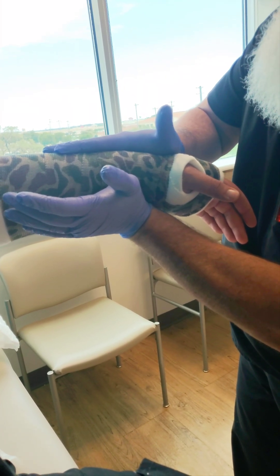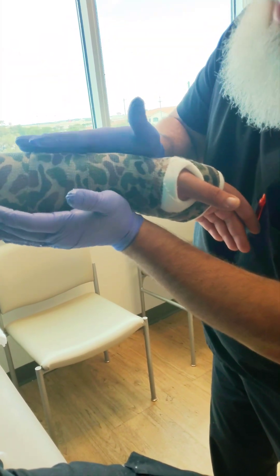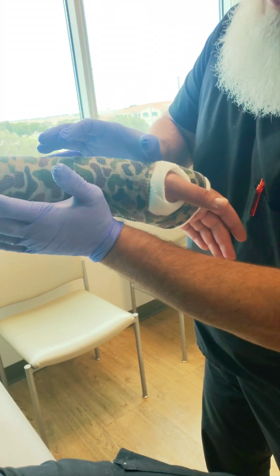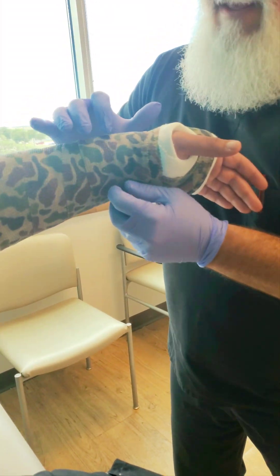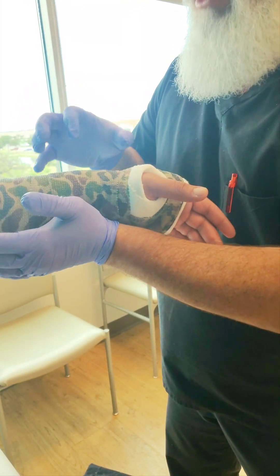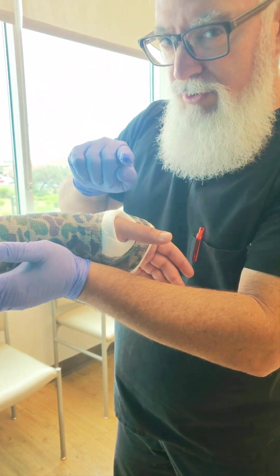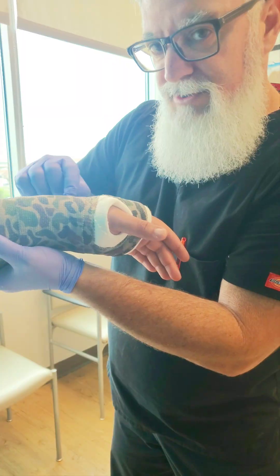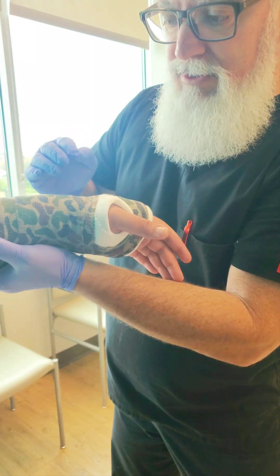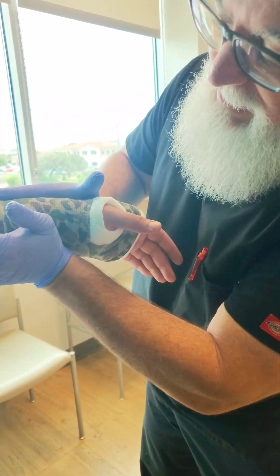Hold it until the cast starts to cure. Every now and then you can move your gloves and rub a little so they don't get stuck to the cast. Now this is really important: some surgeons will not call this a volar mold — they will call this a dorsal apex mold. It's the same thing. Think of the words: dorsal — this is the dorsal surface — and apex, so there's your apex.